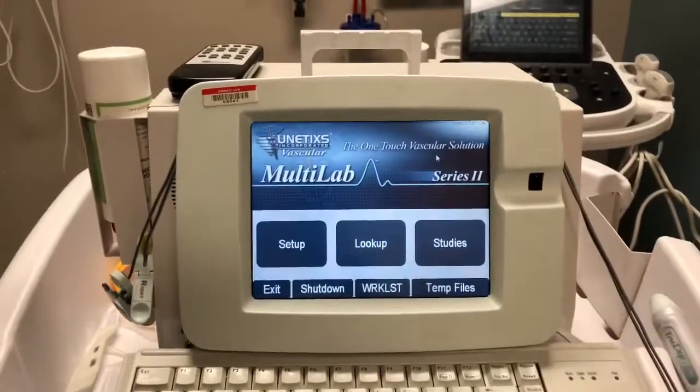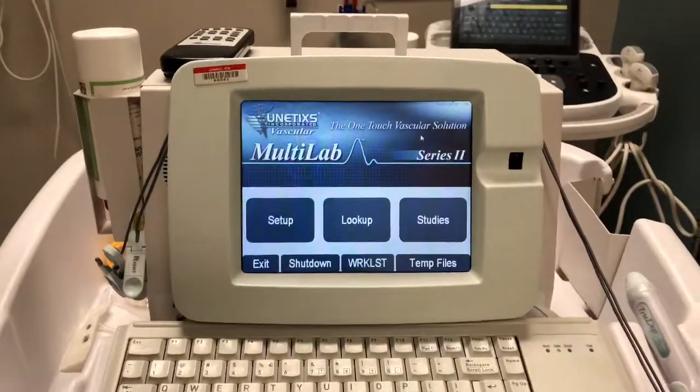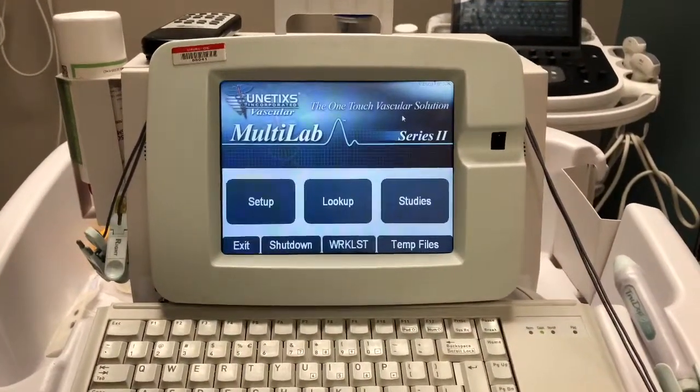In this video I'm going to show you how to use the Unetix Multilab Series 2. Today I will be showing you how to use the ABI feature on the Unetix. This is a Unetix Multilab Series 2.